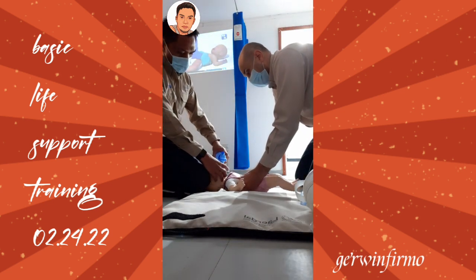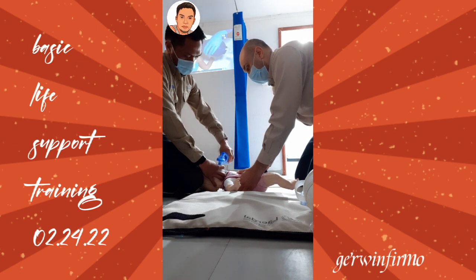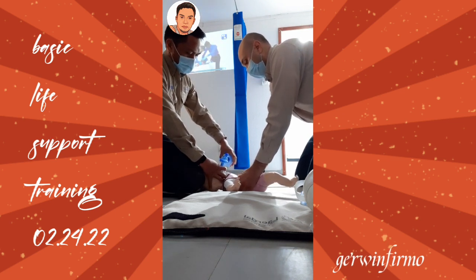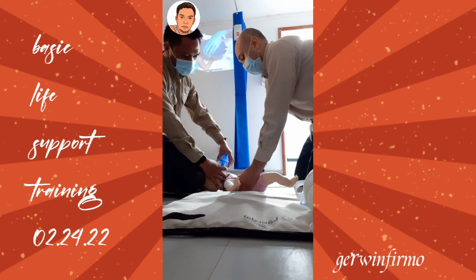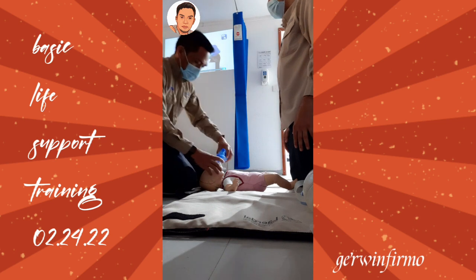1, 2, 3, ... 15. Two rescue breaths. 1, 2, 3, ... 15. Two rescue breaths, 3 seconds. Look for chest rise. 1, 2, 3, ... 15. Two rescue breaths, 3 seconds. Look for chest rise. It's okay? Clear. Last one.